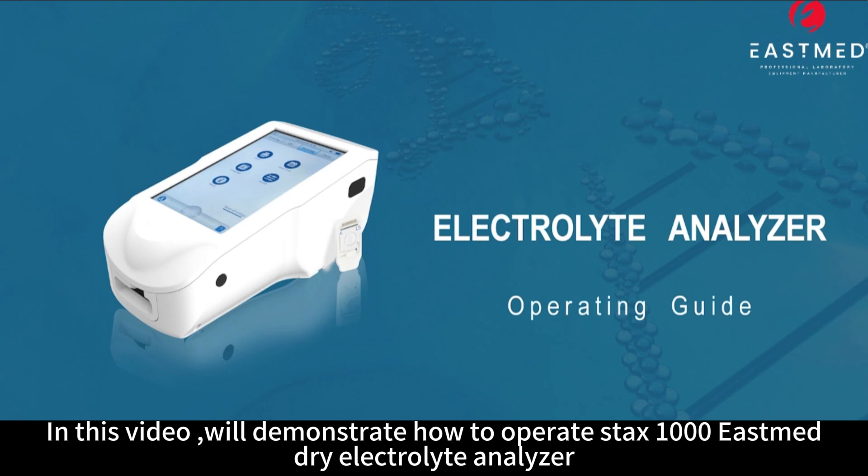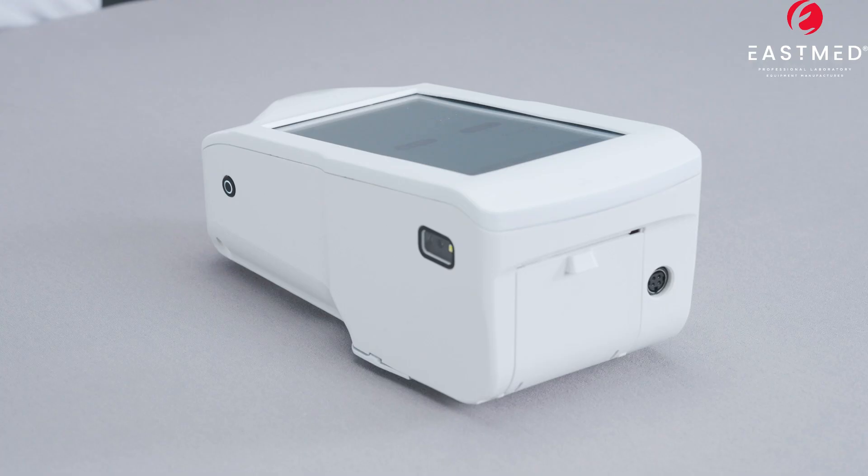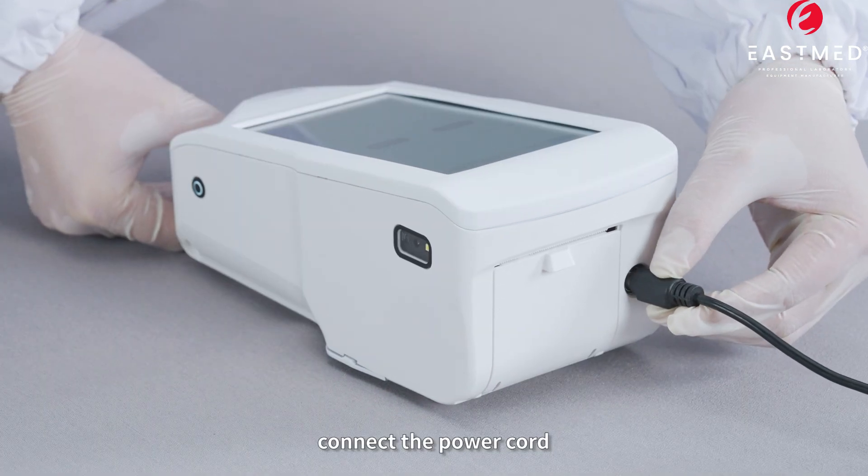In this video, we'll demonstrate how to operate the STAX-1000 EastMed Dry Electrolyte Analyzer. Connect the power cord.